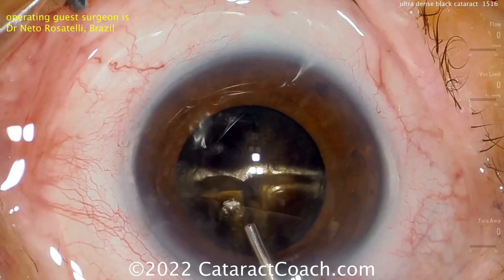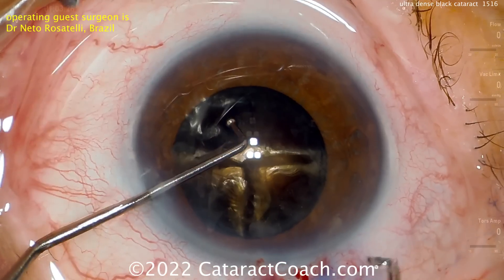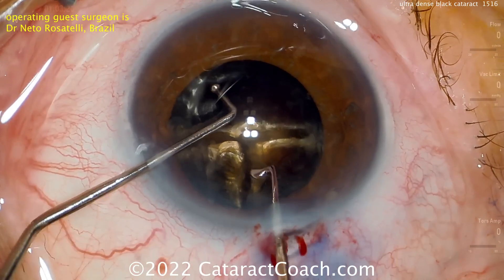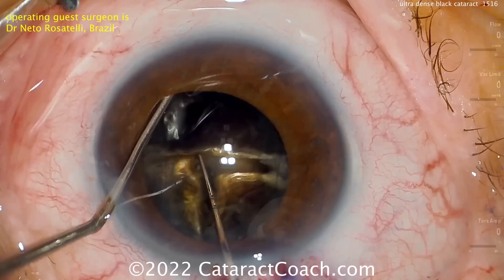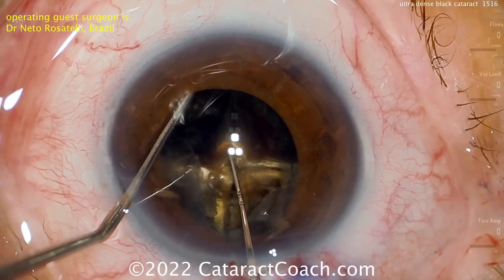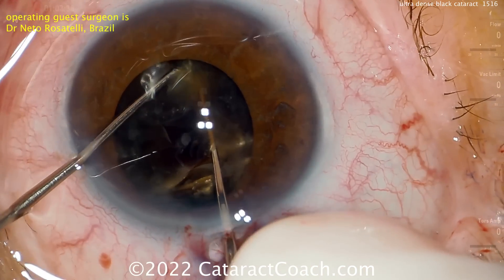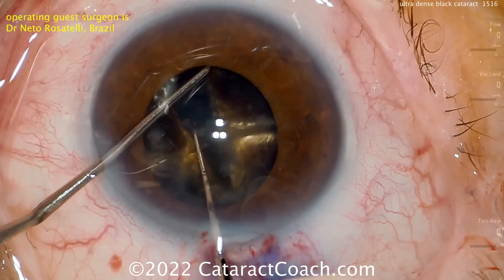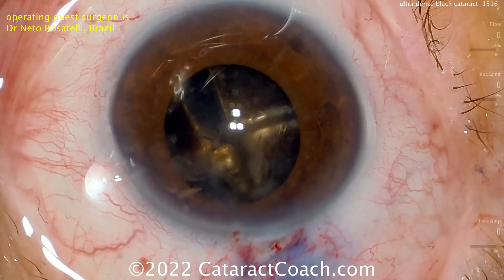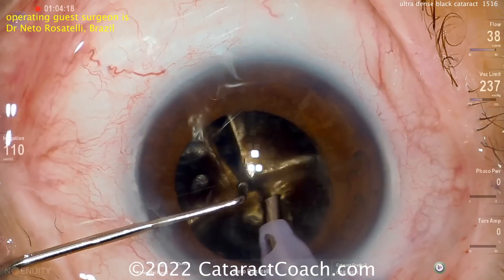More viscoelastic — it's really a smart move to use plenty of viscoelastic because that keeps the anterior chamber maintained. Now again, placing that hook around the lens equator, holding the nucleus still, with careful balance and a tremendous amount of pressure. It really is a lot more pressure than you may think. You have to have great control here, because if you don't, you may have rotation or slip of the nucleus.